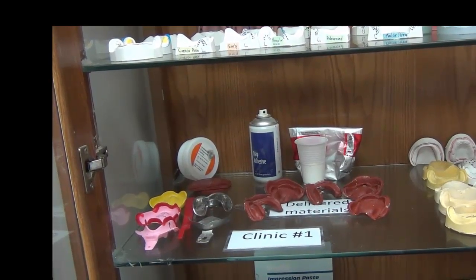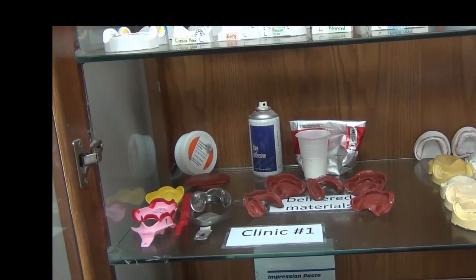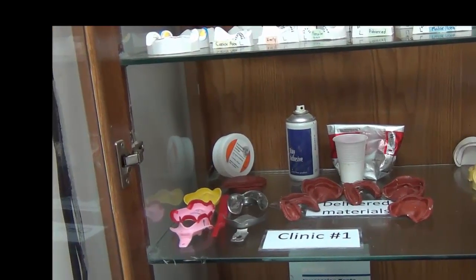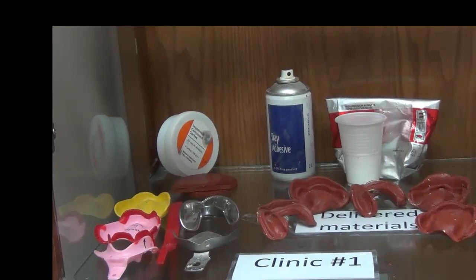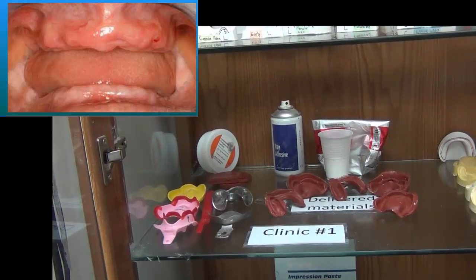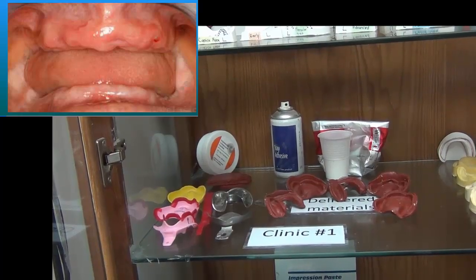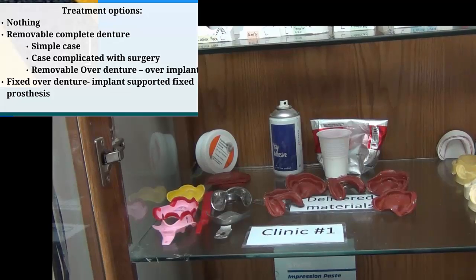Now, in this part of the video, you will be seeing the steps that the patient goes through when he's inside the clinic and what is delivered to the lab and what the lab does. So usually when the patient is seated in his place, the patient is ready. We have examined the patient, made all examination procedures. We made x-rays for that patient. We decided that this patient is ready to receive his denture.